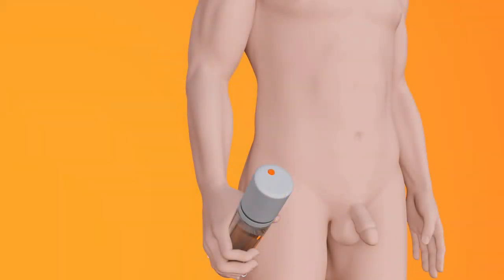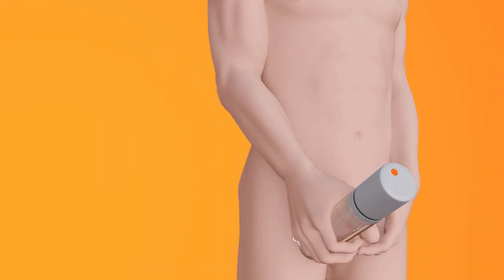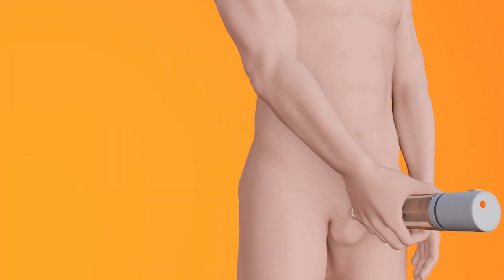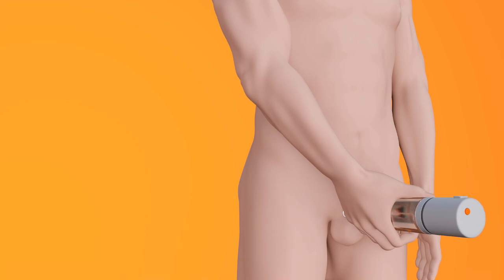Lubricate your penis and the pubic area. Insert your penis into the open end of the cylinder. Make sure to press the cylinder firmly against the body to ensure a good seal.